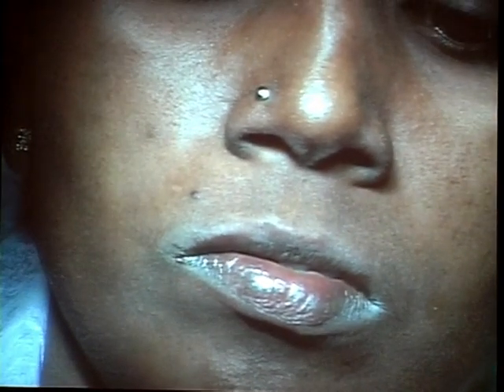What is the application of laser in dry socket management? It's a very good question. What do you do with dry sockets? I was explaining that to a group of people at lunchtime. It's a great use. You have to use the erbium because the problem in dry socket is that there was no clot formation. Can you show the laser ones? Okay, let's finish with this and then.